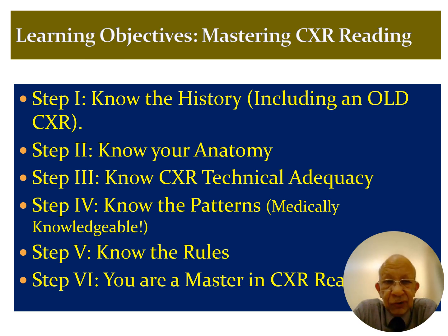Now, for this presentation, this is actually the roadmap that we're going to go through. If you master these 5 steps, or you're aware of these 5 steps, then you will confidently read and interpret chest X-rays. The first step is knowing the history, and that includes an old chest X-ray. Never attempt to read a chest X-ray without having some clinical data about the patient, and having a look at an older chest X-ray if it's at all available.